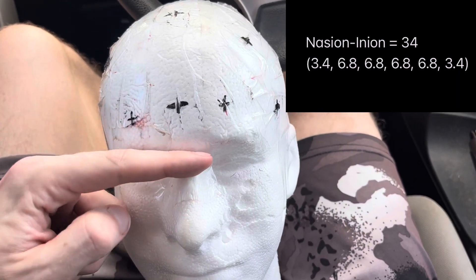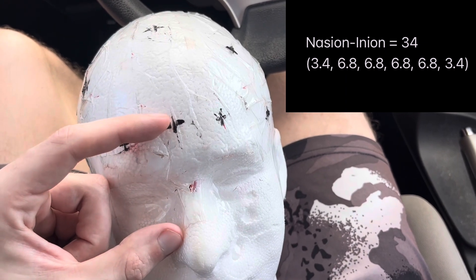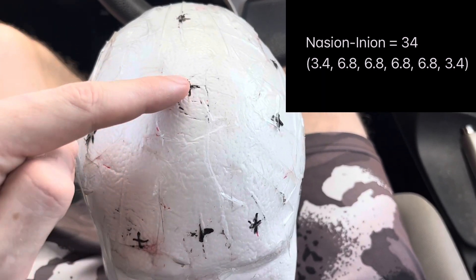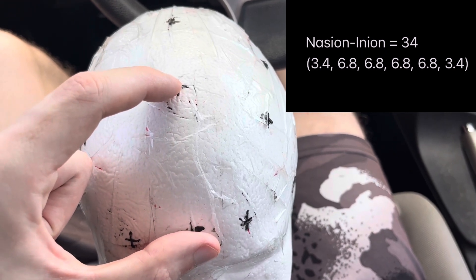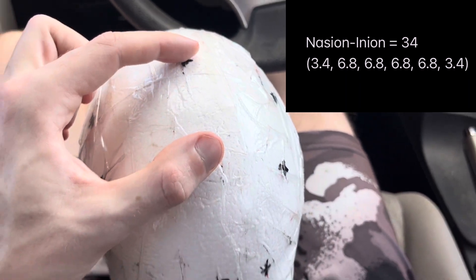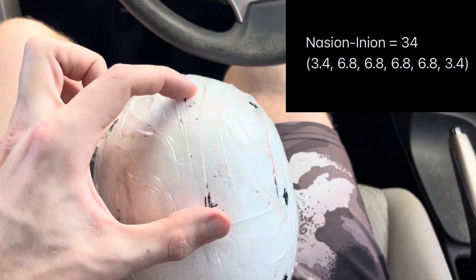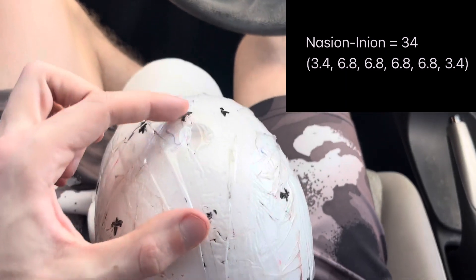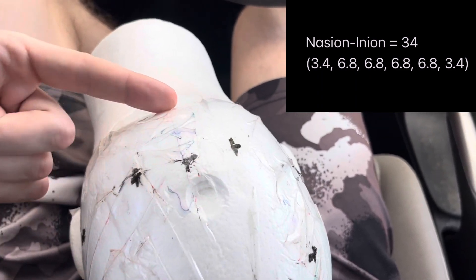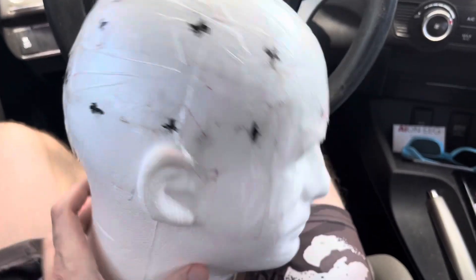For the first measurement, nasion to FPz, you take 10% of 34 centimeters, which gives you 3.4 cm. Then FPz to Fz is 20%, which is 6.8 cm. Another 6.8 cm from Fz to Cz — right in the middle of the head. Then Cz to Pz is another 6.8 cm, and Pz to Oz is another 6.8 cm. If you go one more 3.4 cm, you're back to the inion.